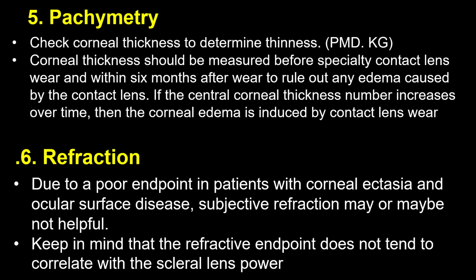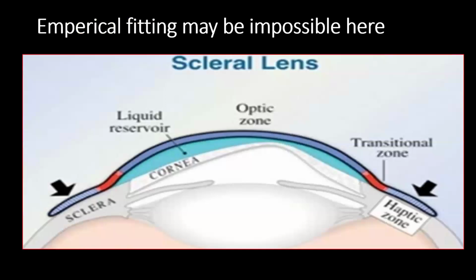And again, the liquid reservoir will also interfere. It's already an optic system on its own, so that can also interfere with the power you get eventually. That's why you need to be aware. It's important to refract, but it's more important to do the over-refraction, which gives you a clearer idea of what you're dealing with.